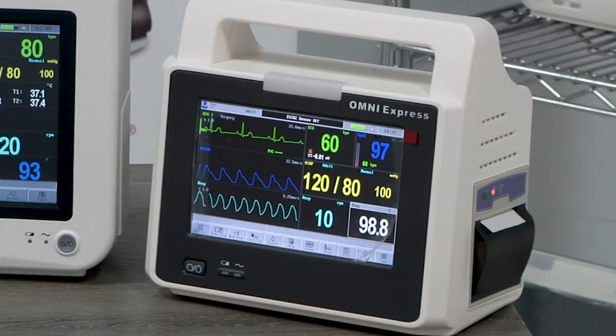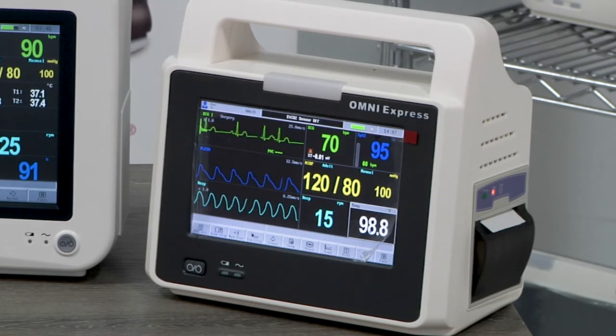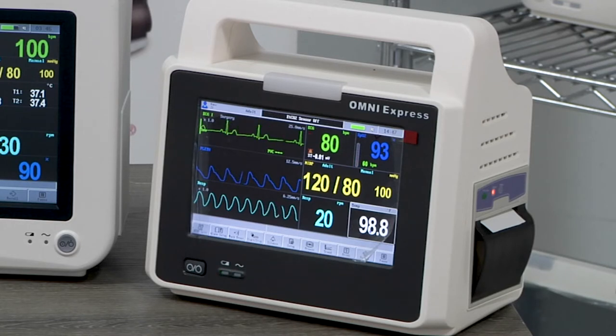Our 7 inch Omni Express monitor has basic functions of 3 lead or 5 lead ECG, respiration, NIBP, SpO2, and one channel of temperature.